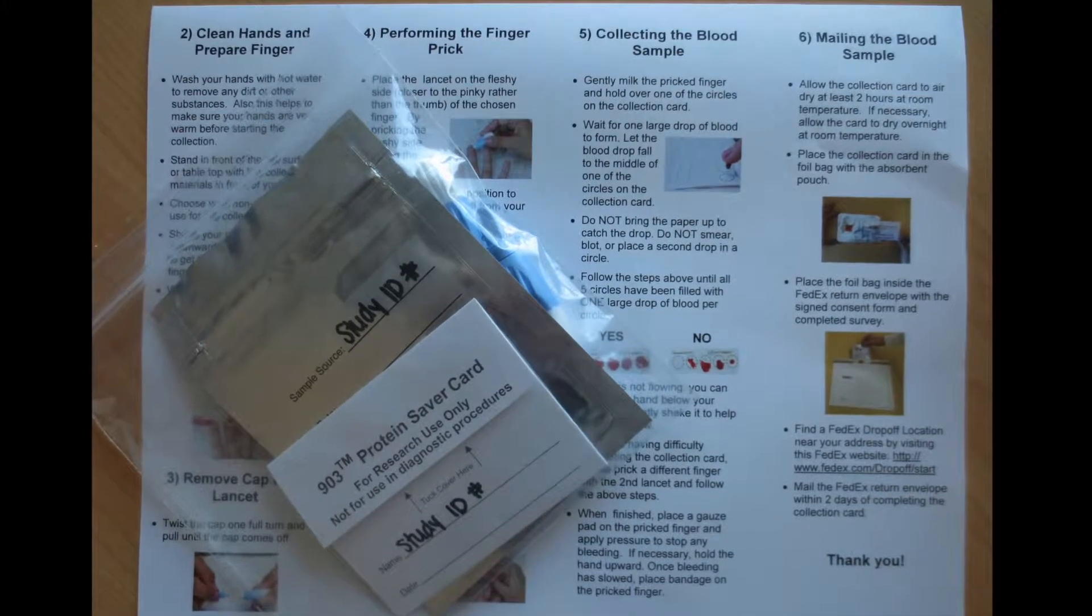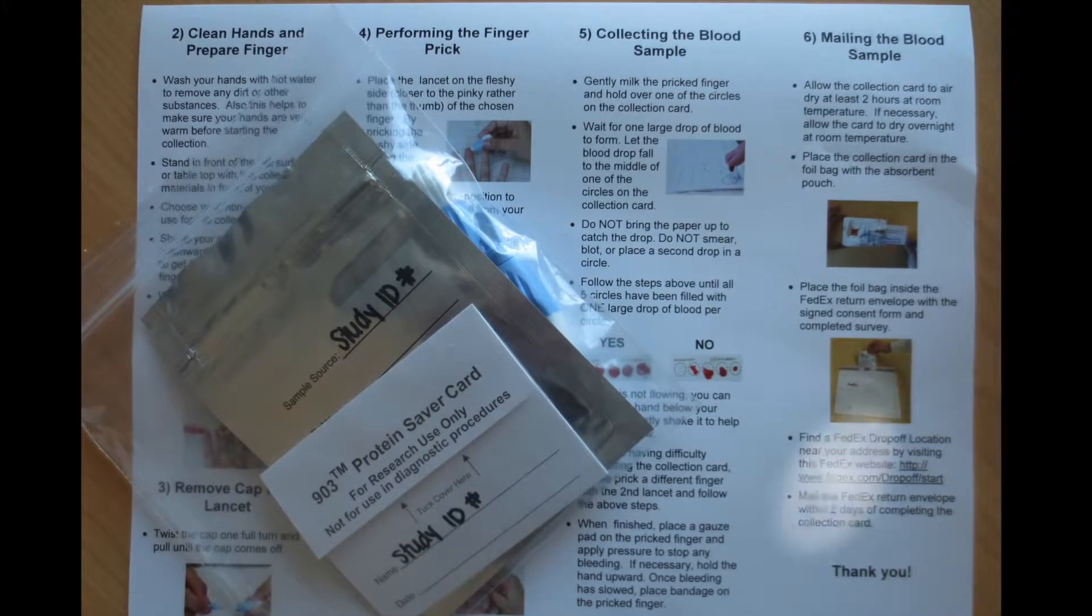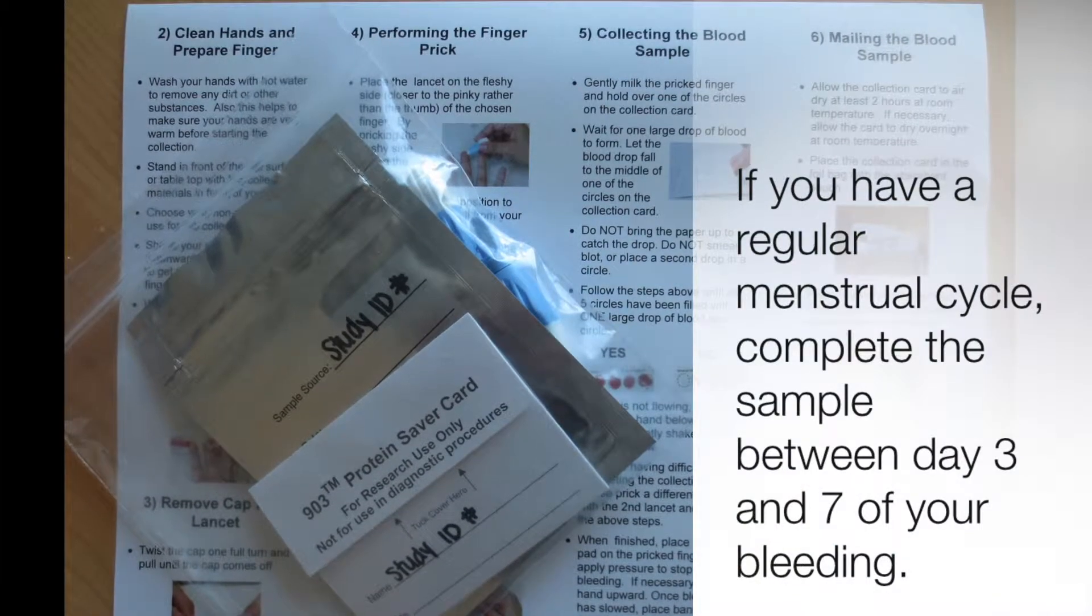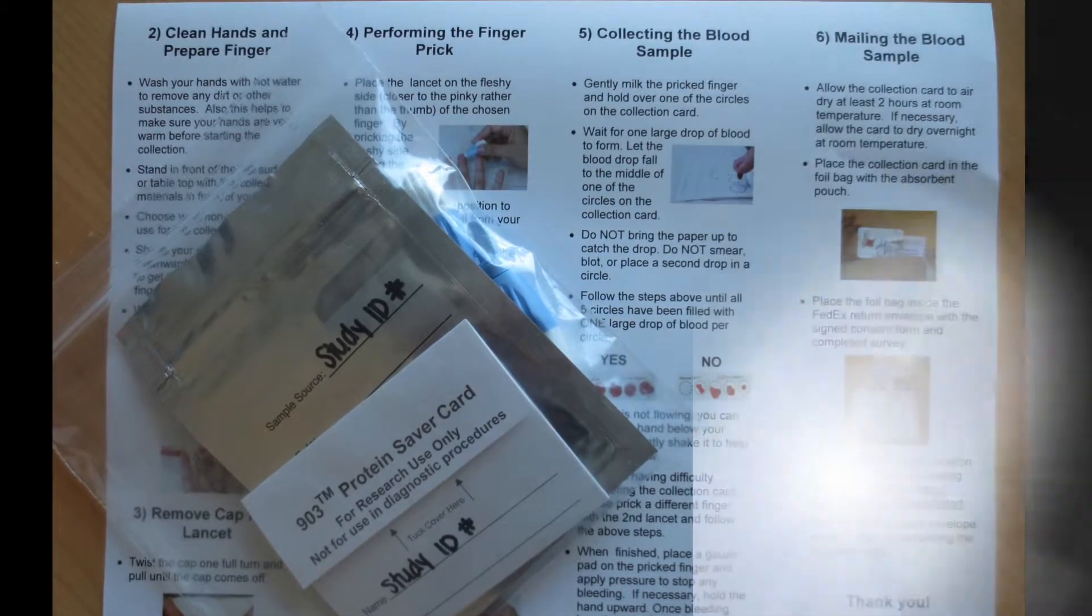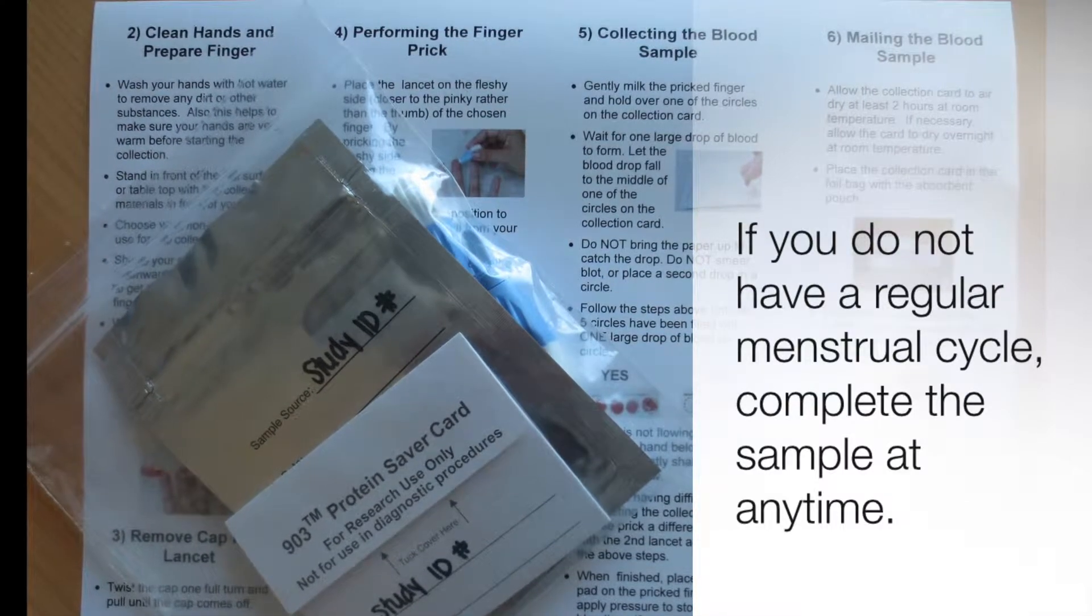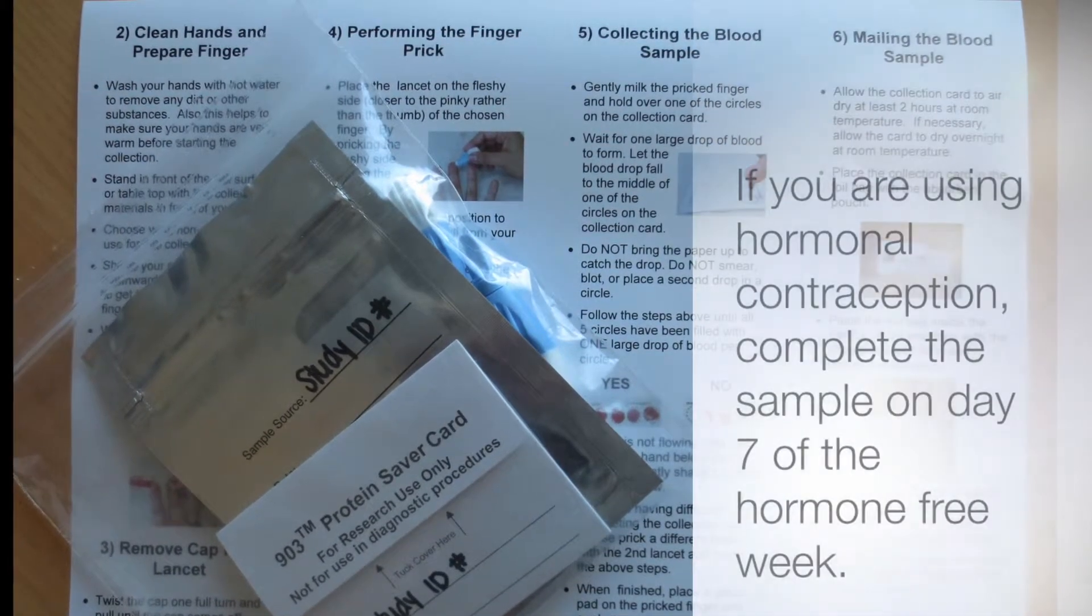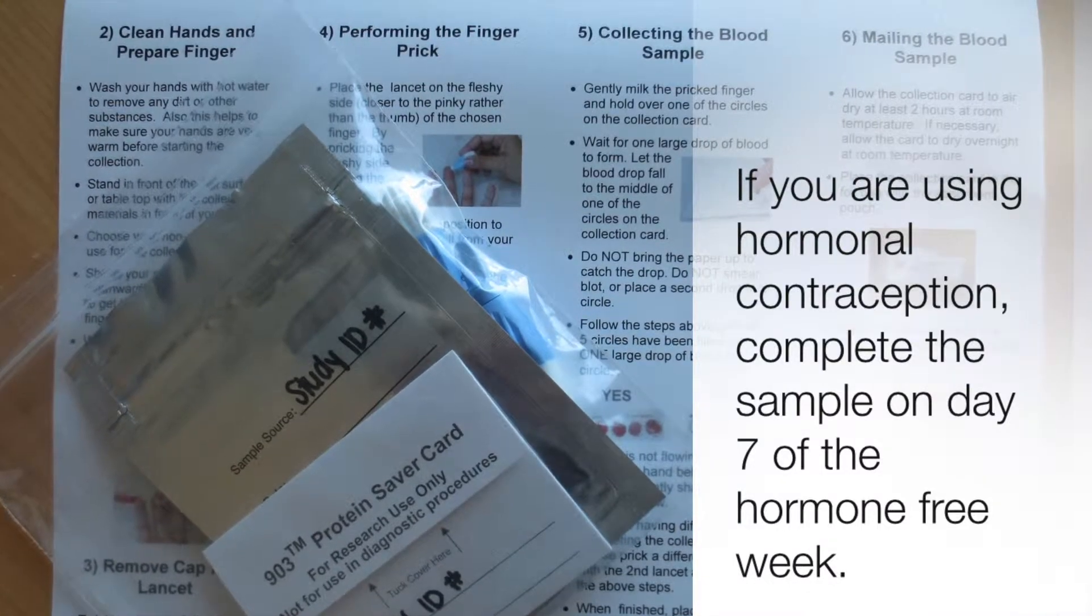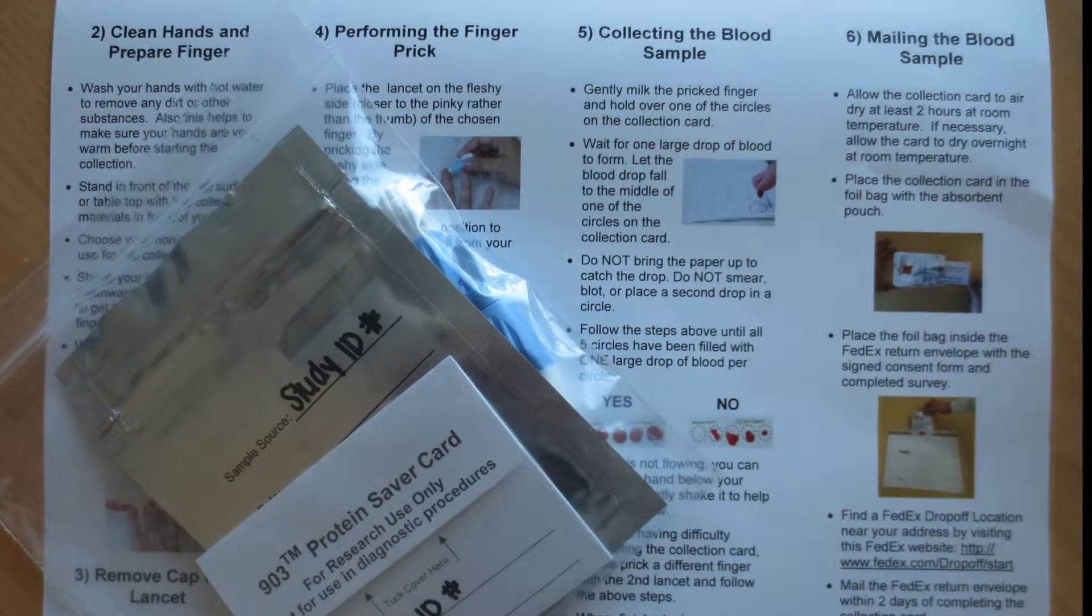Time the collection of your sample to your menstrual cycle. If you have a regular menstrual cycle, complete the sample between day 3 and 7 of your bleeding. If you do not have a regular menstrual cycle, complete the sample at any time. If you are using hormonal contraception, complete the sample on day 7 of the hormone-free week.